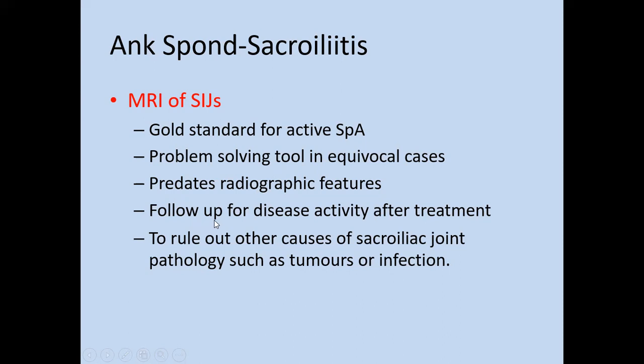Also, even if the patients have been diagnosed and treated, they would come back for an MRI for follow-up in case their disease activity came back. What happens with these patients is that the rheumatologist would treat them with non-steroidal anti-inflammatory medication, and then they will move on to more aggressive treatment. So if they started with simple management therapy and then the patient presented back with disease activity, then we do the MRI scan as a follow-up to detect disease activity.